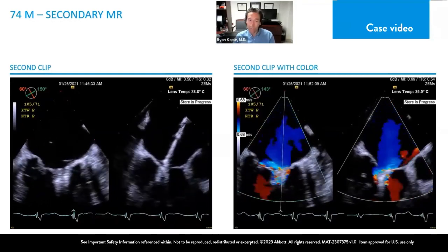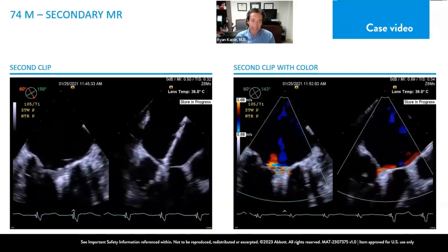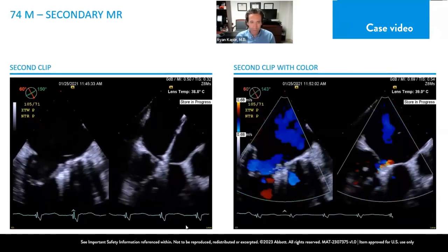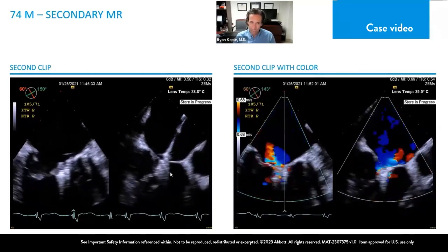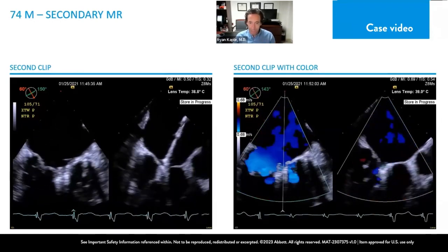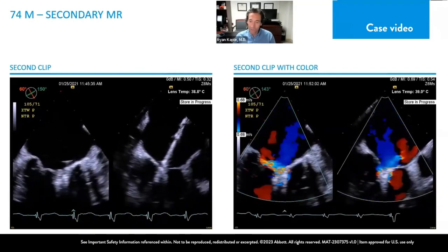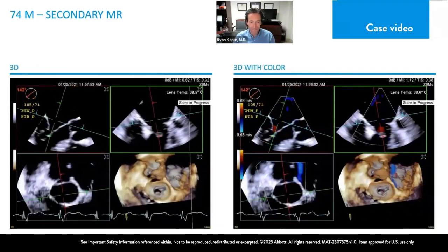And so even more so in these instances, make sure that you're approaching perpendicular. You can see you really only have one view here on that grasping view, but you can tell, at least in that view, we're very perpendicular to the line of the plane of the valve. So when it's a one-way trip, take even extra care to come in perpendicular.